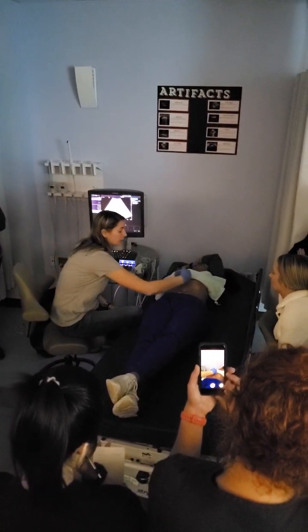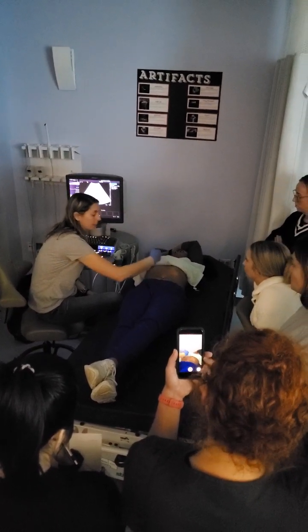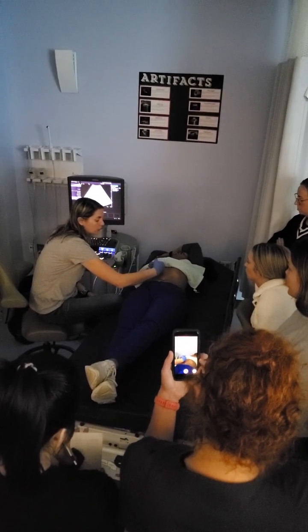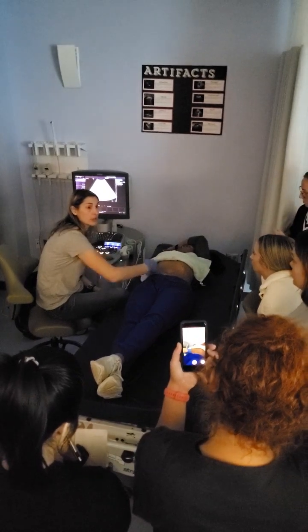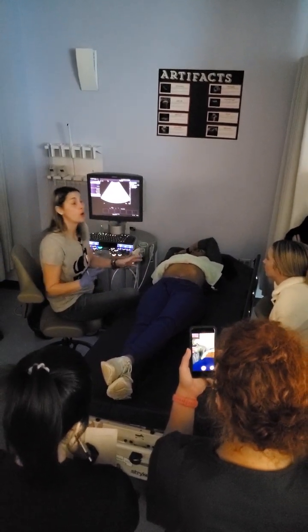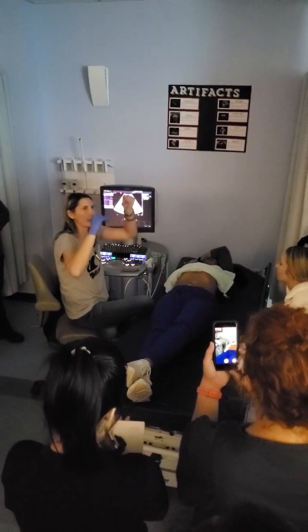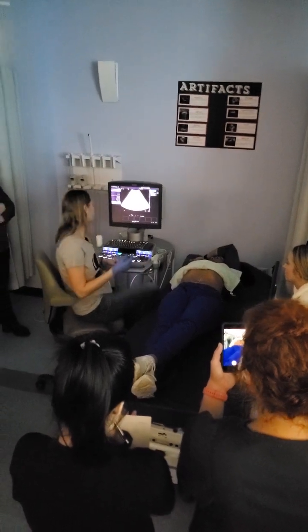The other thing I can do is start superior to that portal vein, using the landmarks dome, hepatics, portal, kidney, and then scan laterally towards the right as I go more inferiorly, and that should pop up. That being said, sometimes it's doing crazy wonky things. You guys have probably seen it when you're scanning that dome and there's a gallbladder sitting there and you're like, what is even going on? So sometimes they can be a little bit wonky, but those are your best bets.